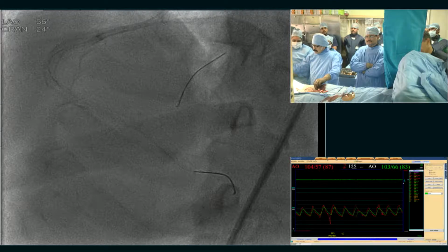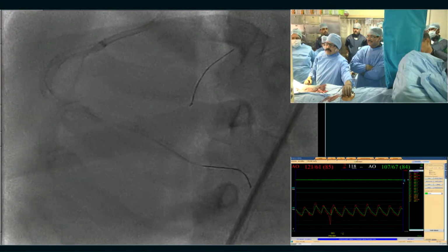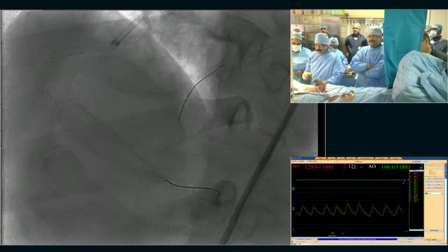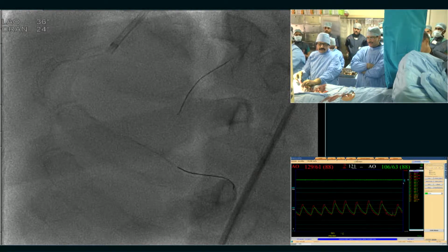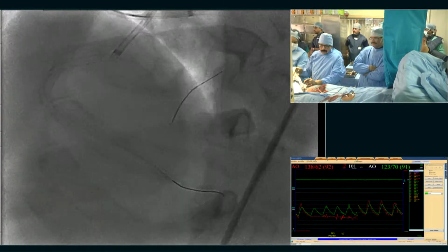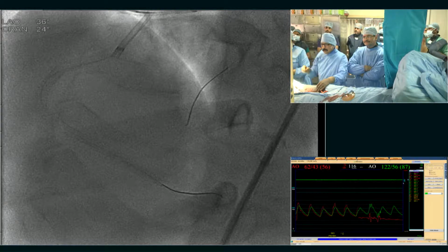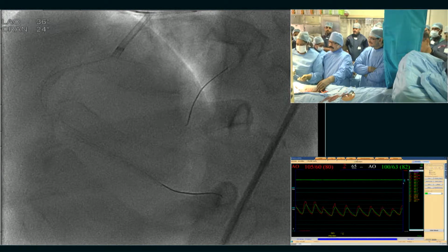So what will be your strategy here for the PLV? I will open it with a Crusade catheter. You need to open the posterolateral branch. Absolutely. Take the microcatheter, Crusade, to enter the PLV with the double lumen catheter. I will open the PDA and go with the antegrade crossing. Give a 3.5 balloon, very short. We can cross with a Sion wire with a double lumen catheter.